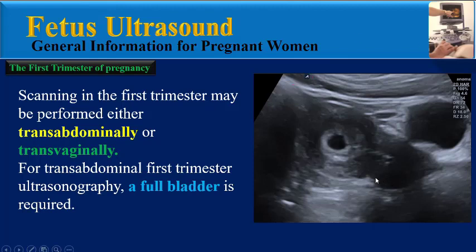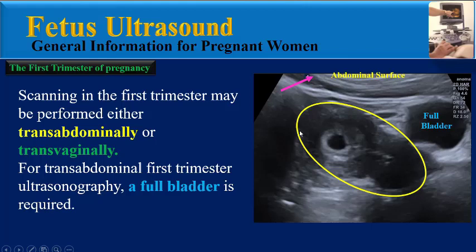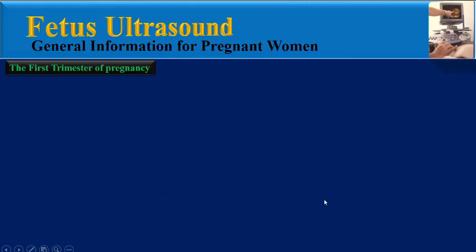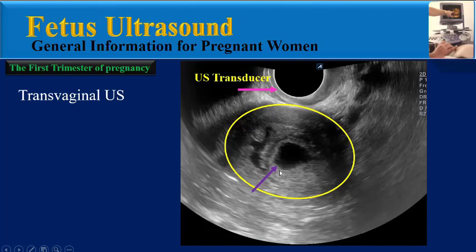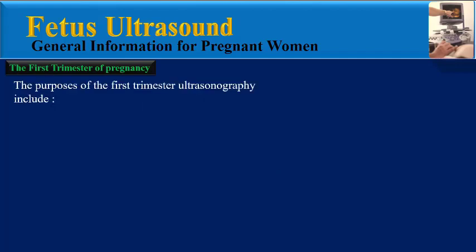This is a transabdominal ultrasound image where we can see the abdominal surface, full bladder, the womb, and the pregnancy sac in the womb. And this is a transvaginal ultrasound image — here is the ultrasound transducer, the womb, and the pregnancy sac in the womb. These are the purposes of first trimester ultrasonography.